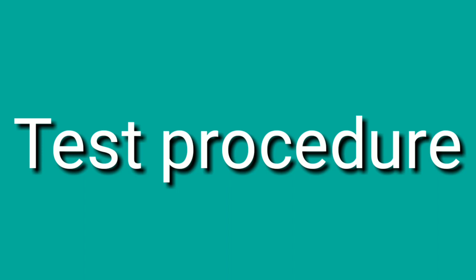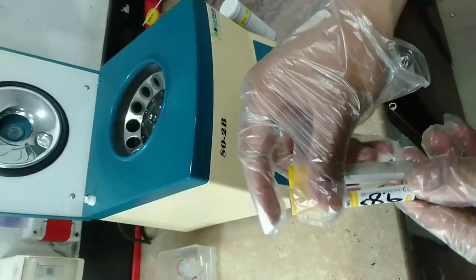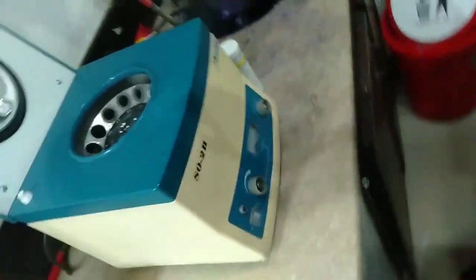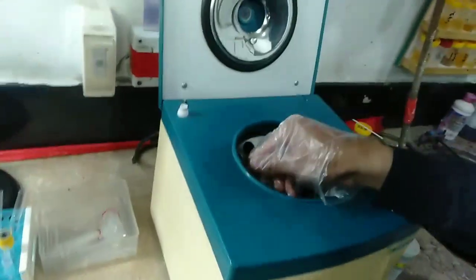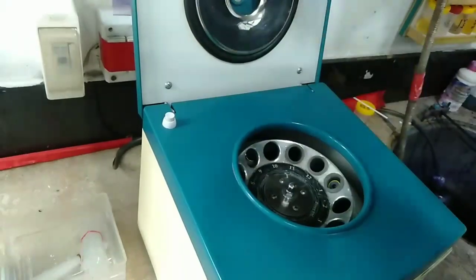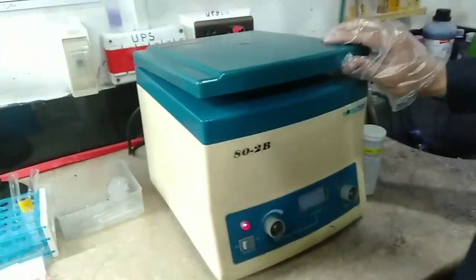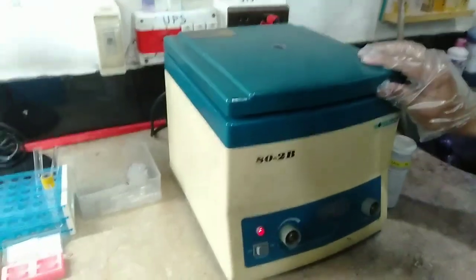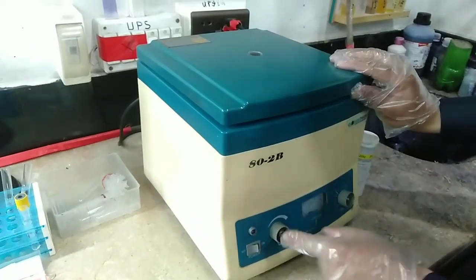Now let's see the test procedure — how to perform this test. First of all, we will take the patient blood in the gel tube, and we will also take another tube containing simple water. Then we will put these tubes opposite to each other to prevent vibration, and then we will turn on the centrifuge machine — as you can see, it's on now.